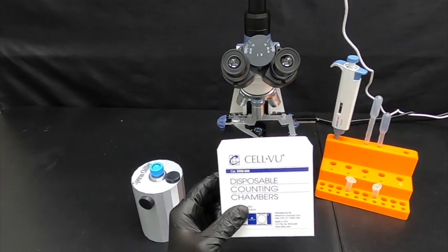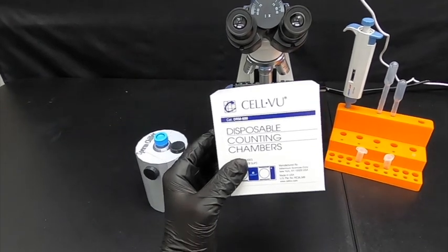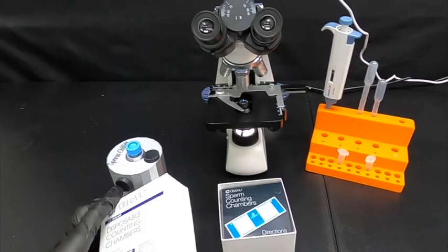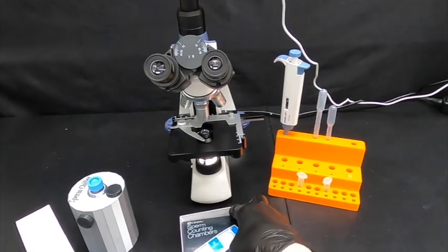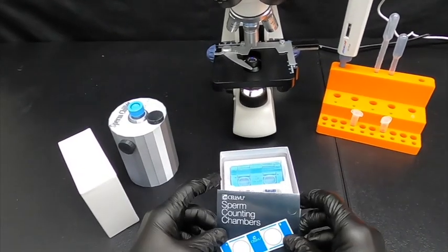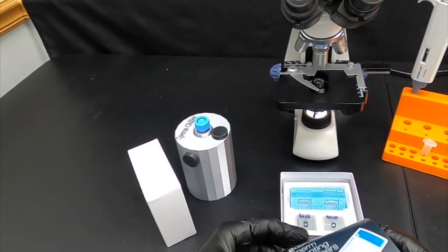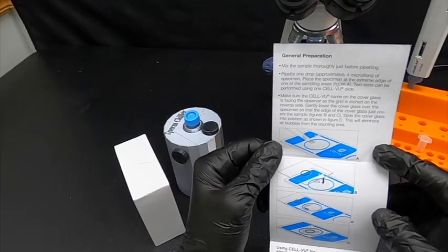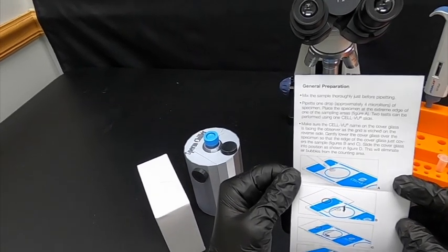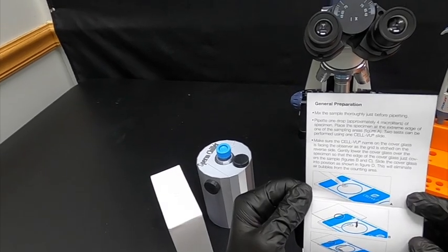Today, we're going to be demonstrating the use of the CellView disposable semen counting chambers. So first, we'll open up the package and take a look at the instructions. These are rather brief and simple. There's a couple steps that we'll go over just to ensure that you see the proper use of it so you get the best results.